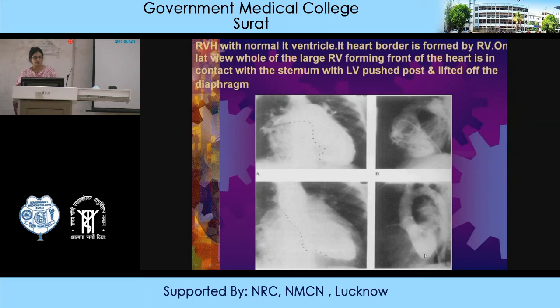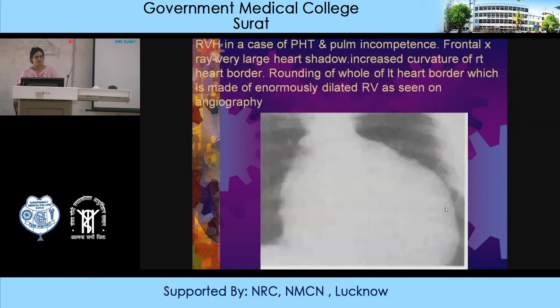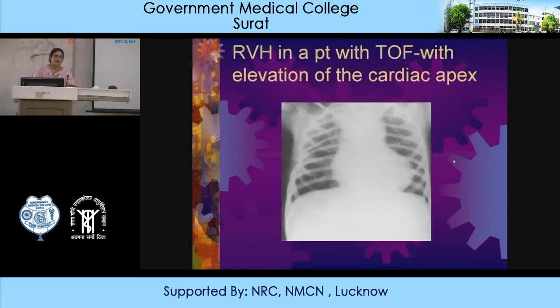You can see right ventricular hypertrophy with rounding of the entire left heart border, which is made up of an enormously dilated right ventricle as seen on angiogram. In TOF with right ventricular hypertrophy, there is elevation of the cardiac apex.